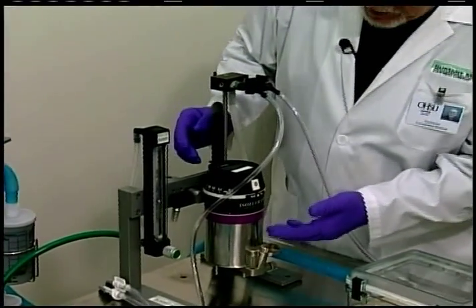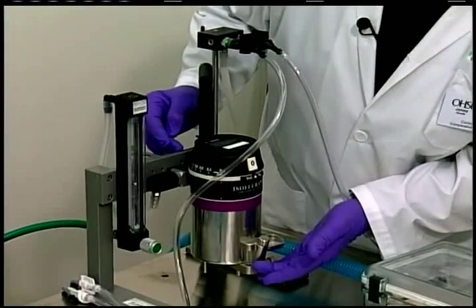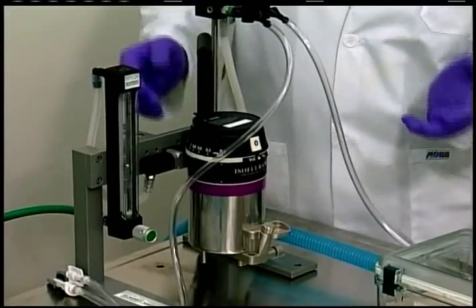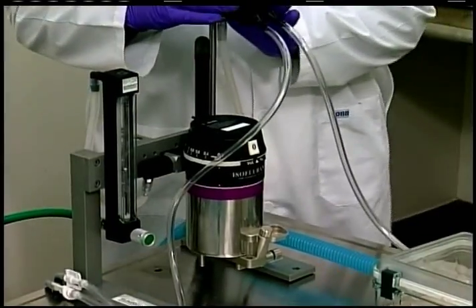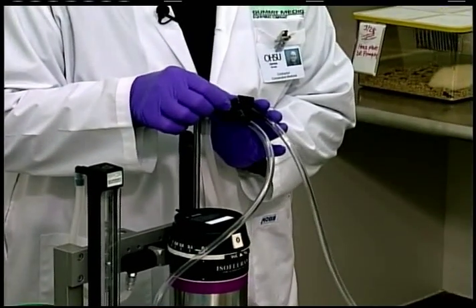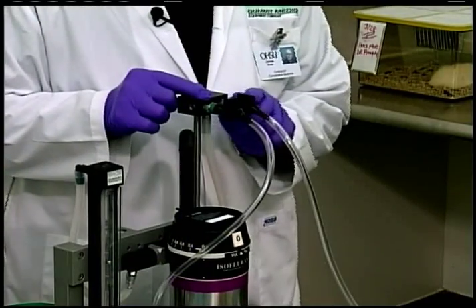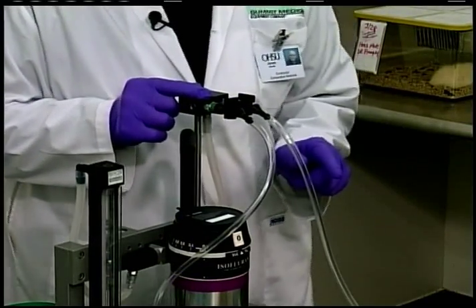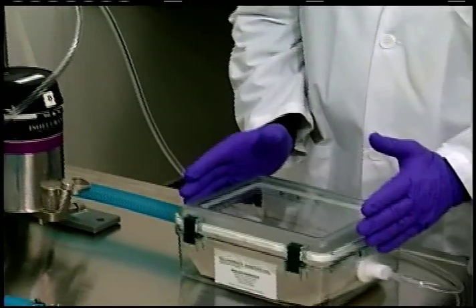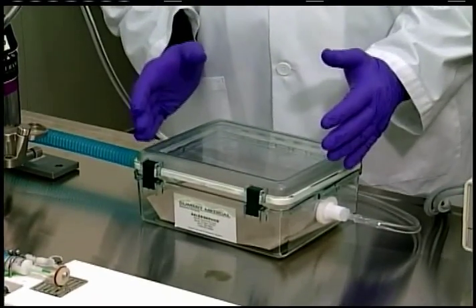Look at your vaporizer and ensure that you have sufficient liquid anesthetic in the vaporizer to conduct the procedure that you wish to do. And ensure that the diverter valve has the stopcock for the non-rebreathing system in the off position and the stopcock for the induction chamber in the on position. What this is doing now is delivering 100% oxygen into this chamber. And now we're ready to put our mouse into the chamber.